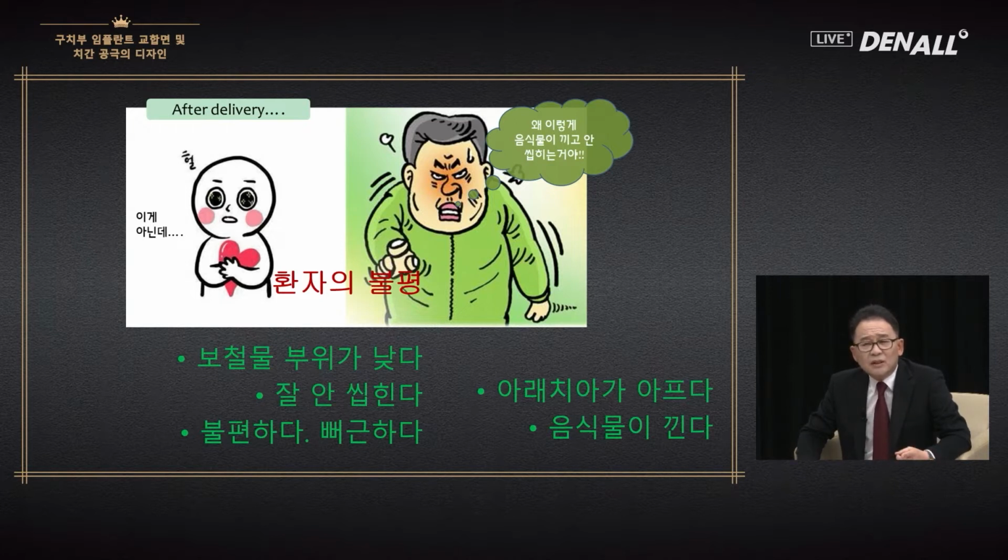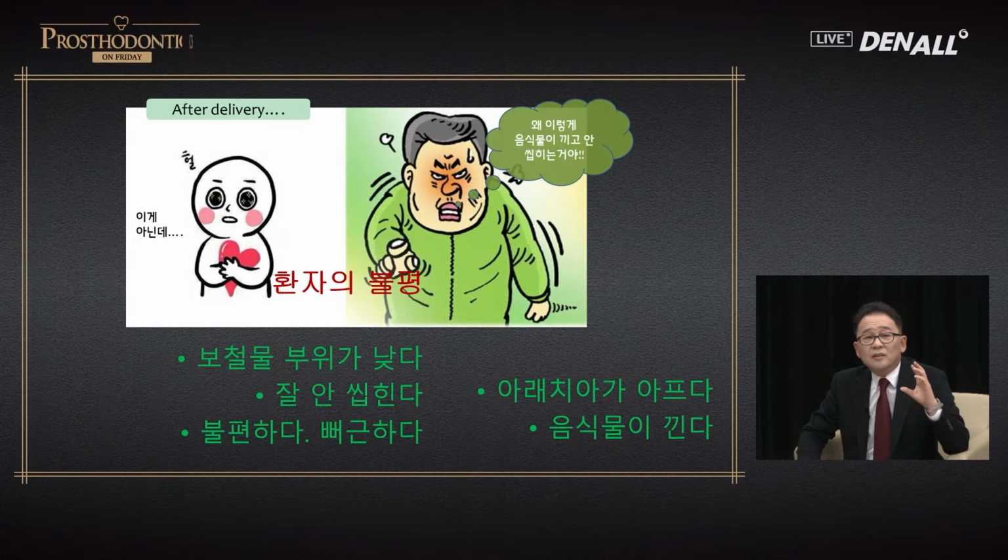And some patients come back on the next day complaining of pain in the lower teeth. I explained to the patient that the space used to be edentulous, missing teeth, so for a long time it was not in the function, therefore the area is constricted. Now it's suddenly in the function and the patient may experience pain for some time.